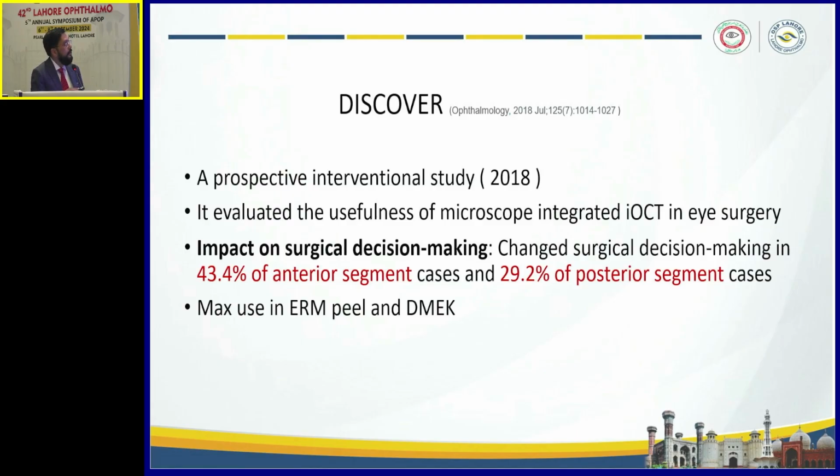In 2018, this study was published with the name of Discover. Most interesting thing is that although we all take intraoperative OCT as a VR tool, and we consider that it's very useful in macular hole surgery and ILM peeling and all that, what they found was that in 43.4% of the anterior segment surgeries, they changed their surgical decision due to this intraoperative OCT, while the ratio was almost 29% for posterior segment surgery. So if I say that probably it's more useful as far as anterior segment surgery is concerned, it won't be very wrong.